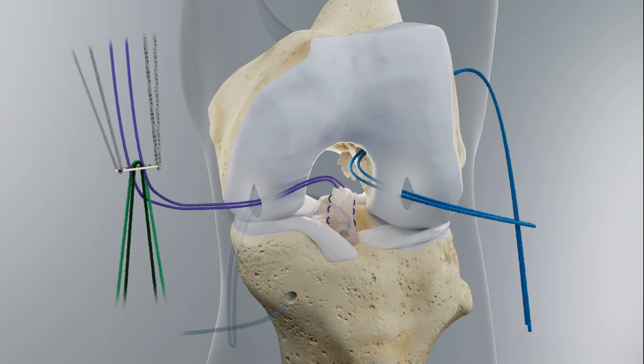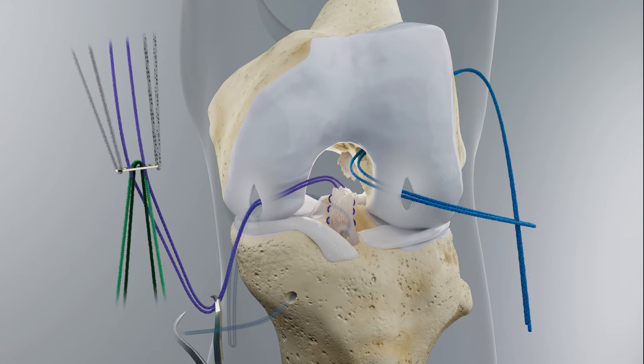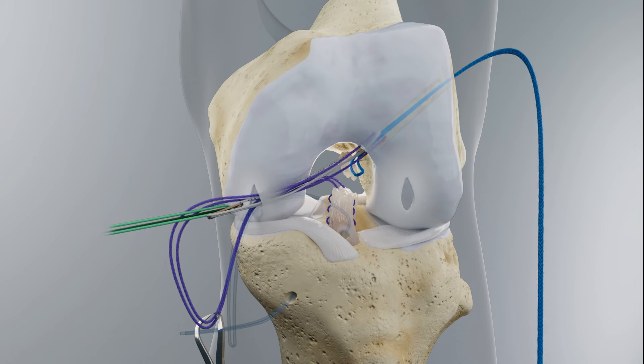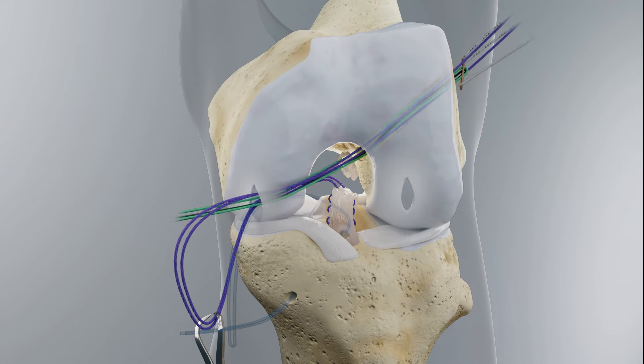Reserve a 5–6-inch loop of stump suture through the medial portal and hold it in place with a towel clamp to enable control over the stump for the remainder of the procedure. Pass the button through the femoral tunnel and flip on the lateral cortex, ensuring it is flush to the bone.